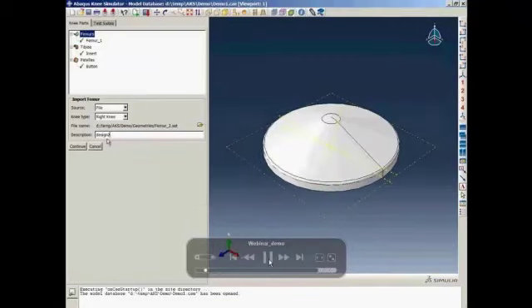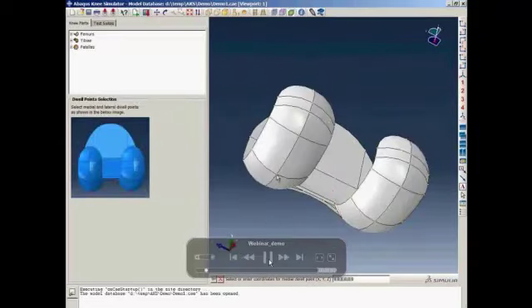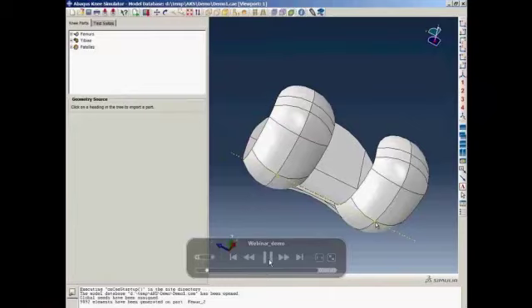The user can give a description of the components imported. Next, the knee simulator asks for a few landmarks on the implant components. So for each implant during import, different landmarks are requested. These landmarks are needed for both meshing the components and also aligning the components in the assembly. First is the plane on the femur components. Next, we ask for the 2 dwell points on the femur components. I know that different companies may refer to these landmarks using different names. What the dwell points are in reality are the lowest points on the femur components when it's in its designed vertical location. So if we drop a ball on that surface, the 2 points should be the location where the balls will settle eventually. The user can either pick this point from the screen or they can enter the coordinates.